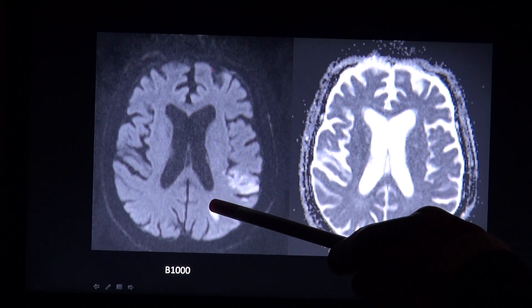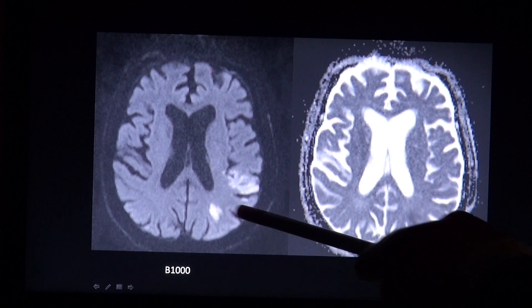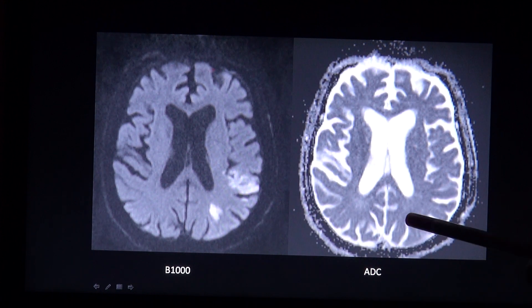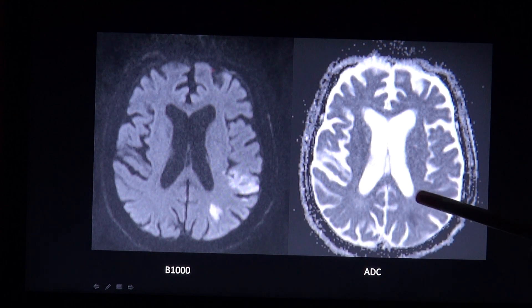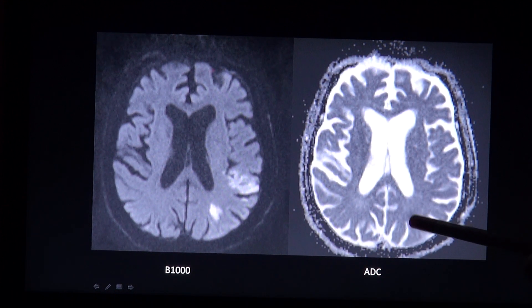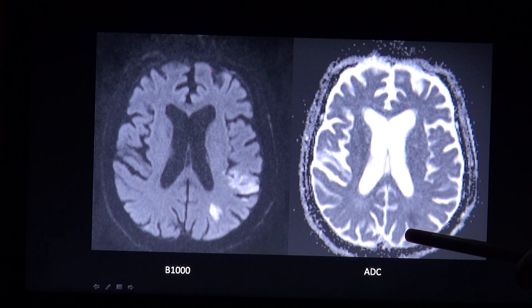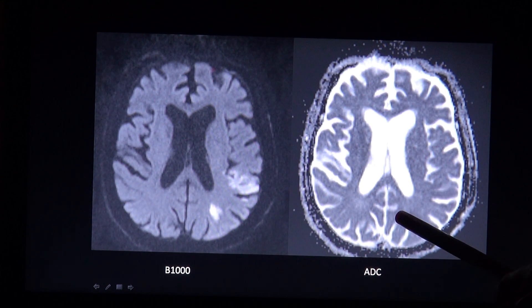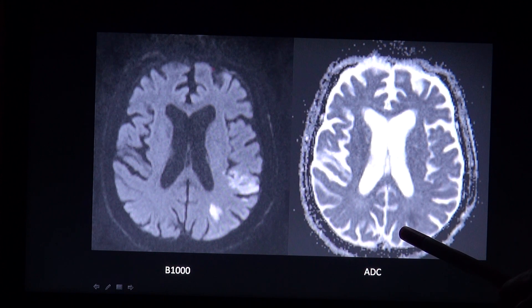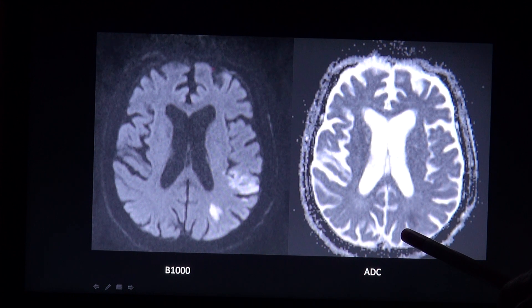You see the bright lesion on the B1000 image, and compared to the ADC map, this lesion is dark. Another lesion with restricted diffusion is an abscess, so DWI can also help to differentiate between an abscess and a necrotic brain tumor, which may be indistinguishable on other sequences.